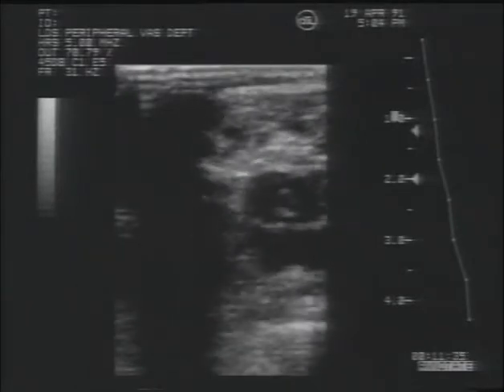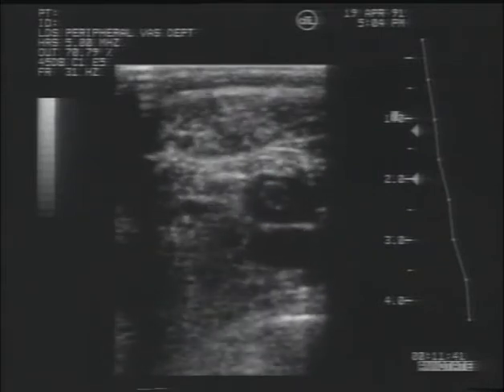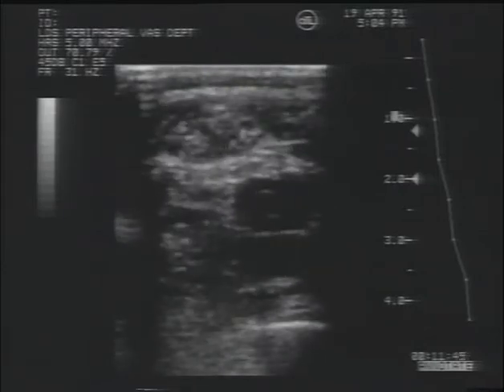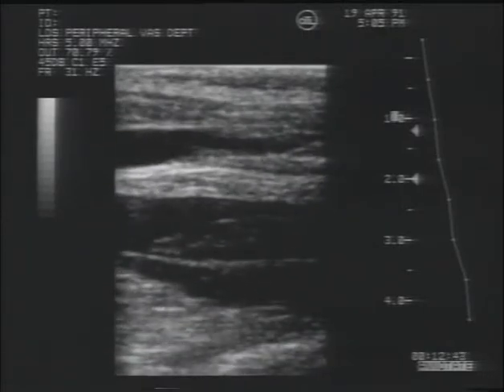Newly formed thrombus in the venous system resembles a gelatinous substance. Under ultrasonographic examination, it has a lightly echogenic appearance and deforms slightly when pressure is exerted over the vessel. The longer the thrombus is present within the vein, the more tightly contracted and therefore rigid it becomes.